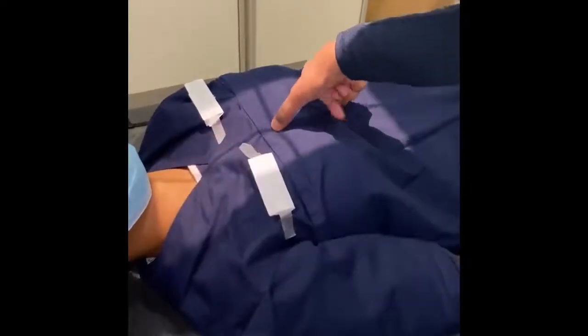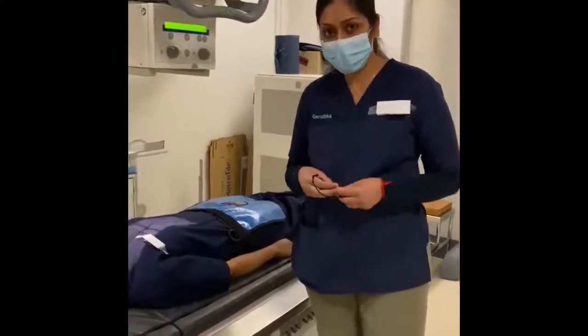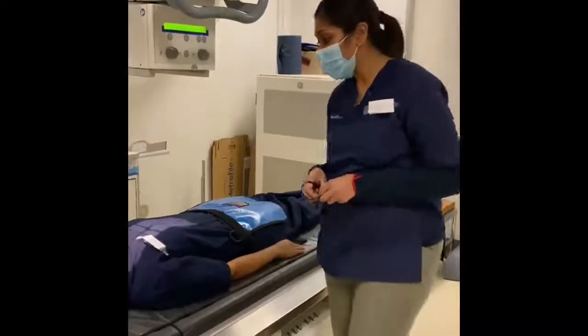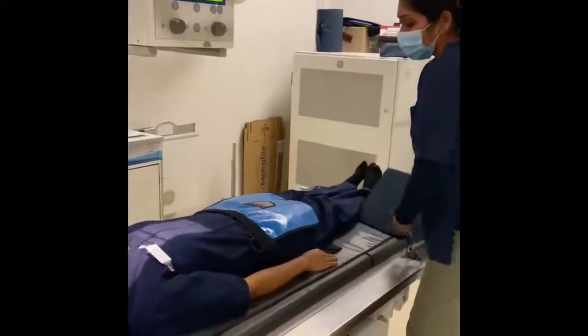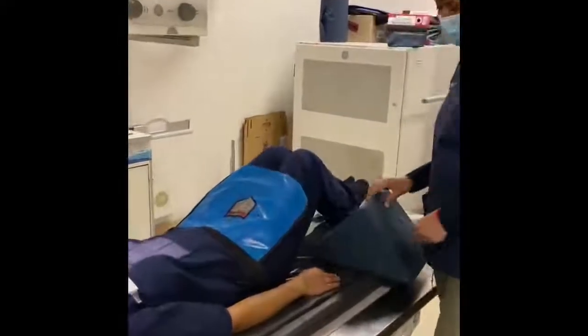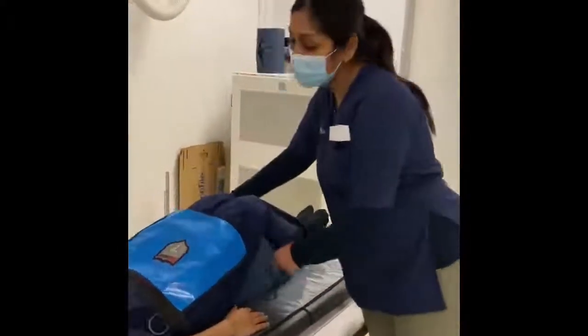The centering point for your T-spine AP is your mid-sagittal plane, midway between the jugular notch and the xiphoid process, which is normally at the level of T7. Some of the things that you can do to improve your image quality for the T-spine: one is to flex the knees slightly, so that you reduce the curvature of the spine. If you have a cushion, you can put it under your patient's knees.